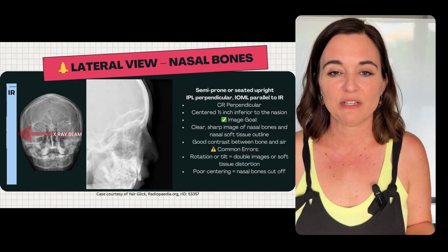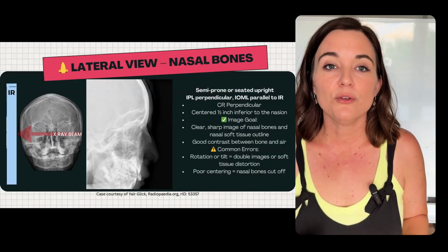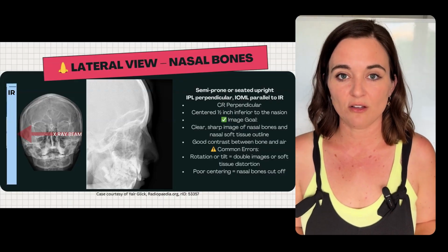This procedure is most common for nasal bone fractures. Use low kVp to preserve soft tissue detail.